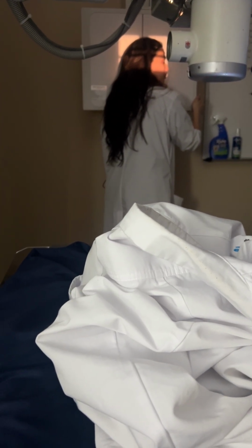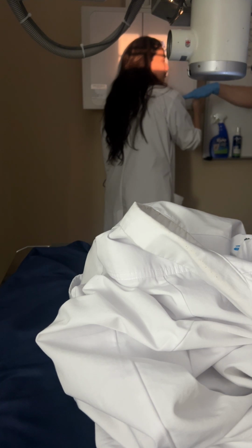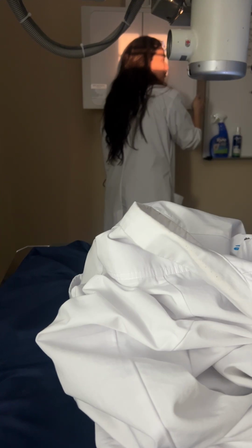You said the EAM is at the bottom of the IR, or like the collimation? Sorry? It's at the bottom. The CR is 2 inches above the EAM. The IOML is parallel to the bottom edge of the IR. Okay? So the infraorbitomeatal line parallel to the bottom edge of my IR. Questions? And this is for the lateral facial bone? This is lateral skull, lateral cranium. We're still on cranium. Okay? Still on skull.